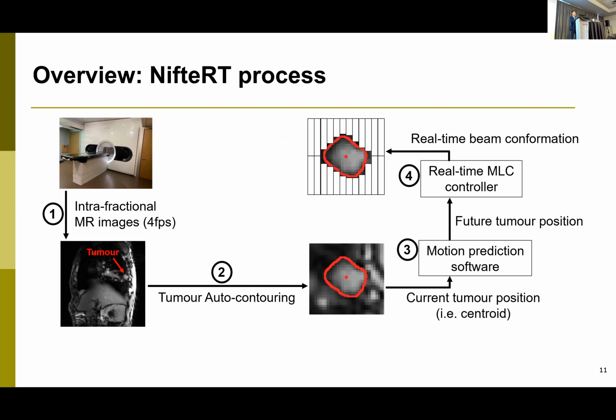So I had to put in some sort of motion prediction capability, right, to compensate for the tumor motion during the system delay, or time delay, we call it.